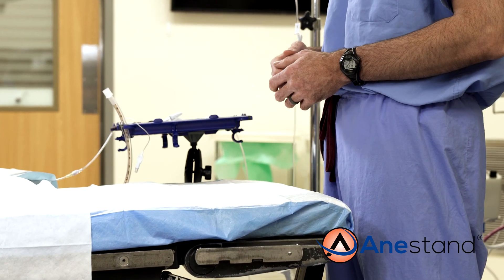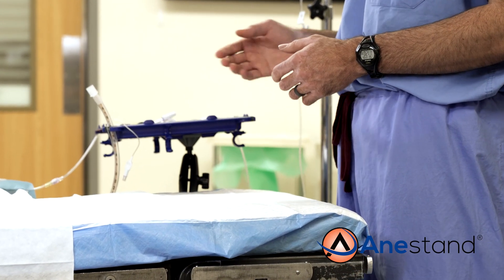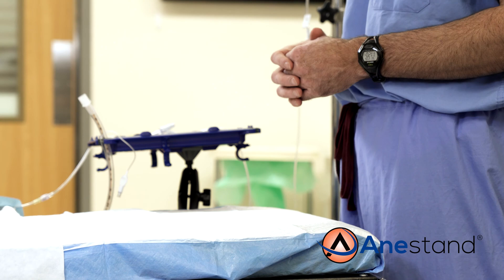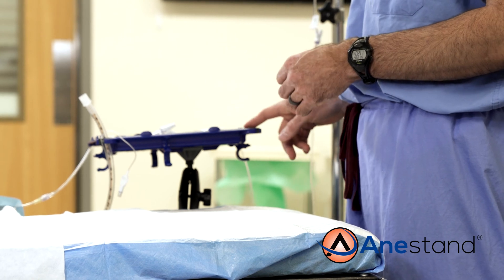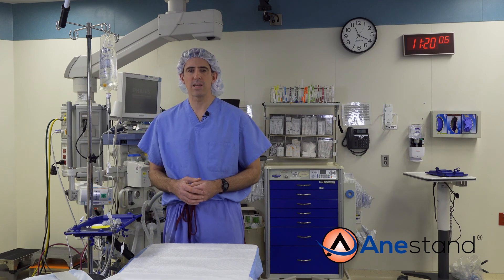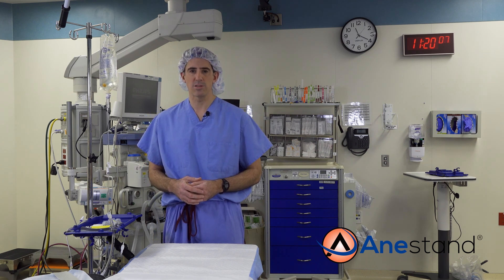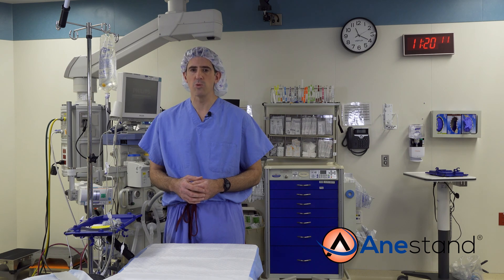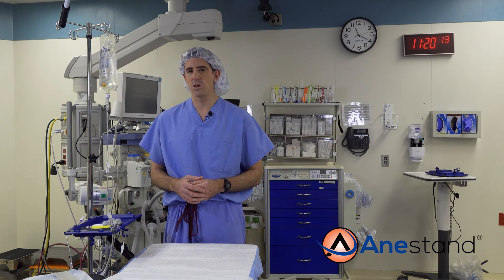For setup, I have alcohol swabs ready, the port locked in the IV clips, and your suction tubing will be secured in the corner grip. After pre-oxygenation, I clean my port and then quickly administer our medications followed by intubation. In those rapid sequence inductions with obesity and multiple comorbidities, getting your medications on board quickly is a big help.